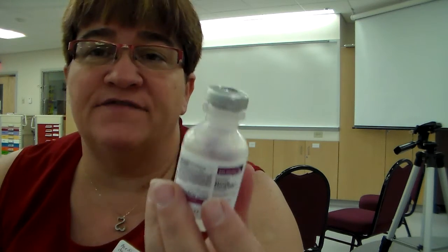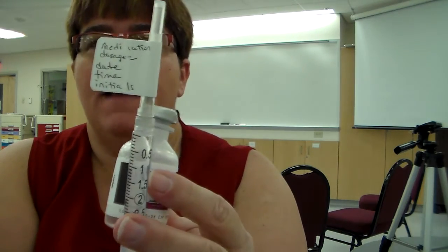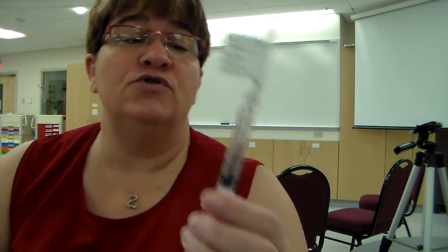Okay. Now, if you're in a facility that scans, you're going to have to take this with you in order to scan the medicine, right? Okay. So you take your medicine and your syringe and you go to your patient's room, okay? All right, so that, oh, I guess I should have told you that, right? So we removed it. Whoops, I forgot about that. So I just do it and forgot to tell you, right?